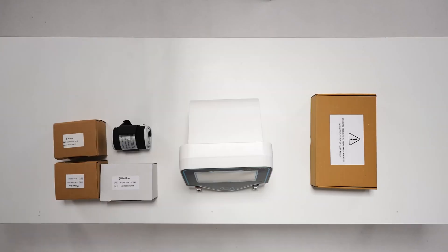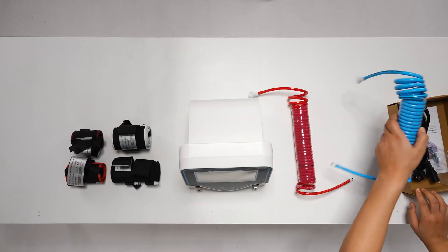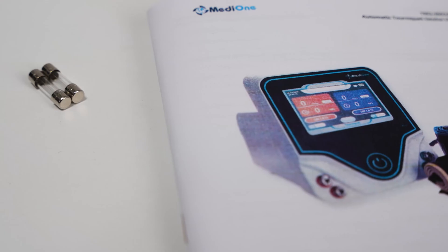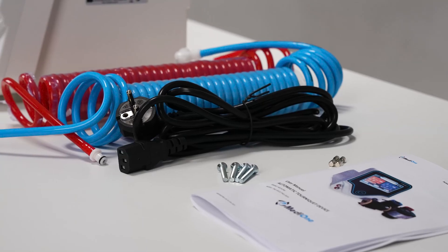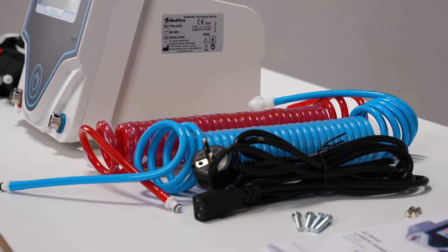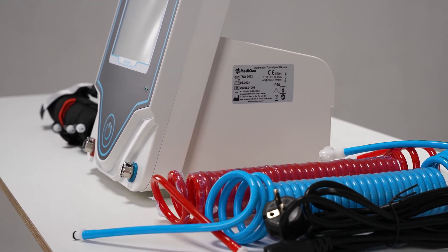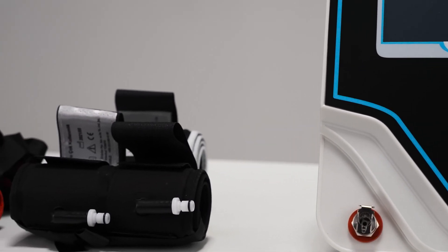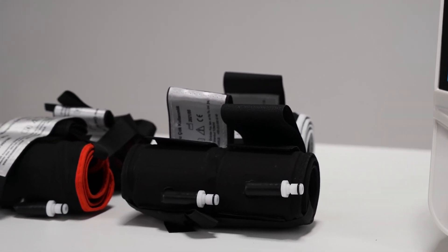First, when we remove the cuffs' boxes, we remove the auxiliary equipment box. Inside the auxiliary equipment box, there are two fuses, two hoses, one power cable, and a user manual. After removing the cuffs from their boxes, all the materials are now out of the box.